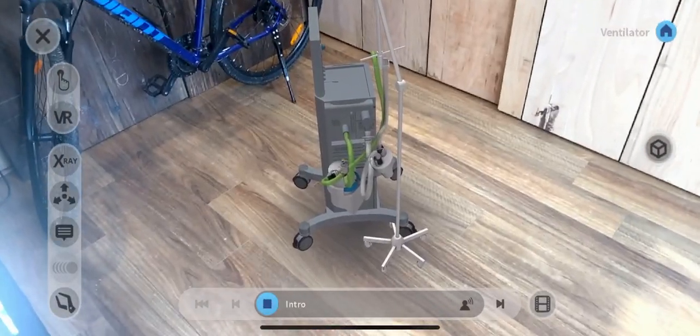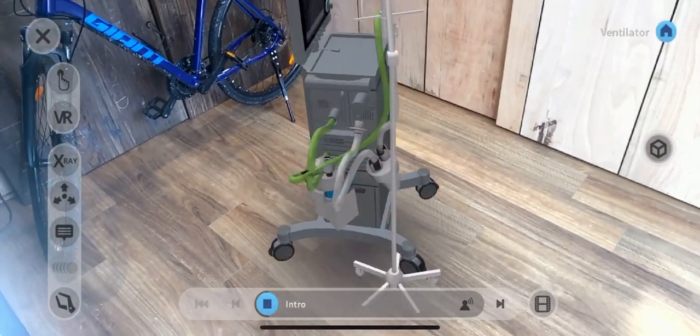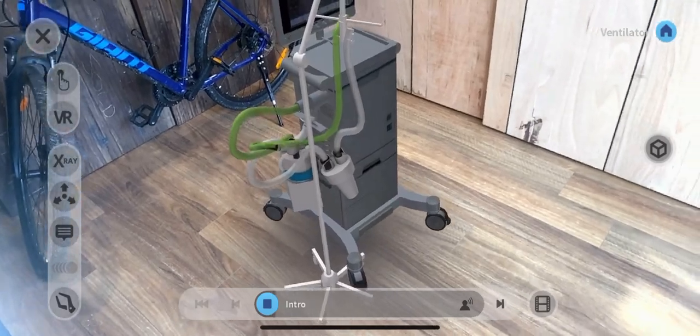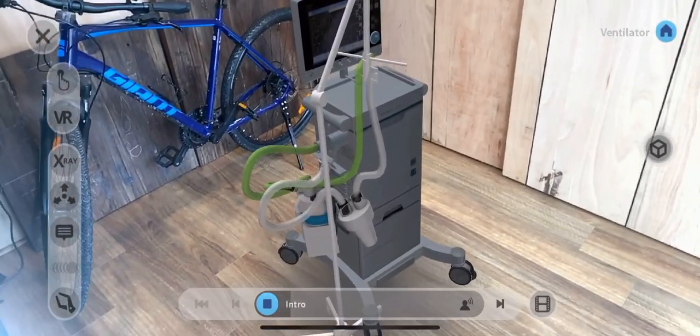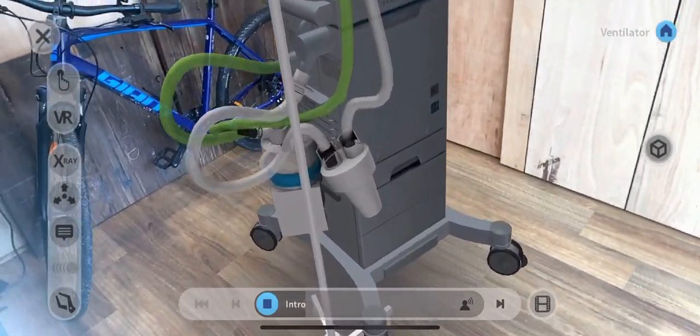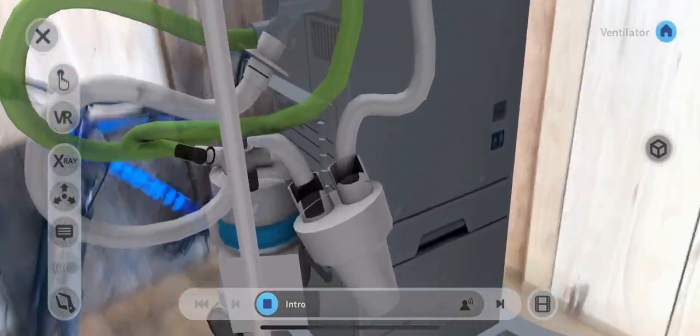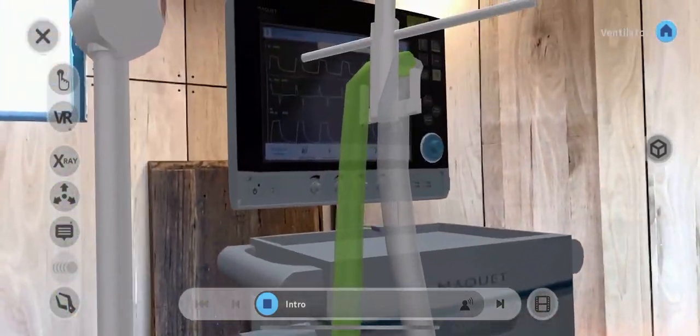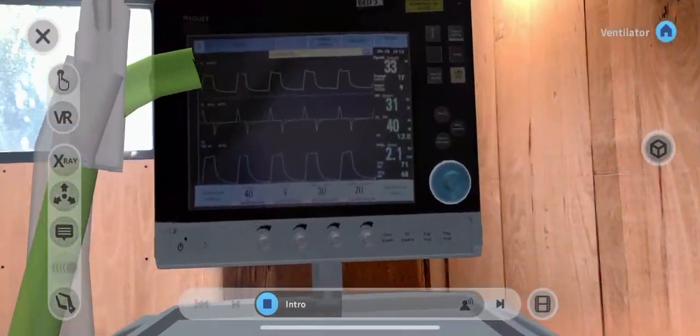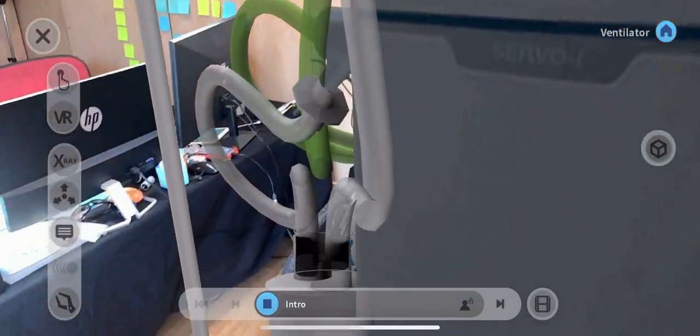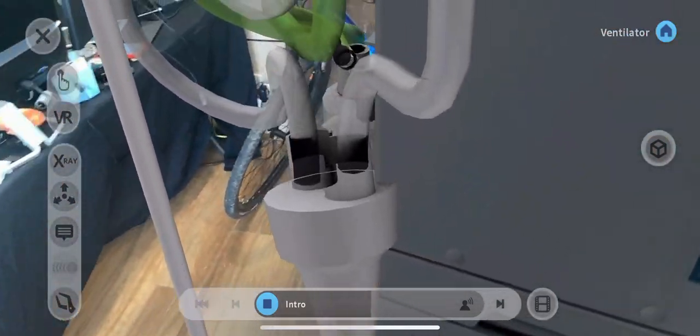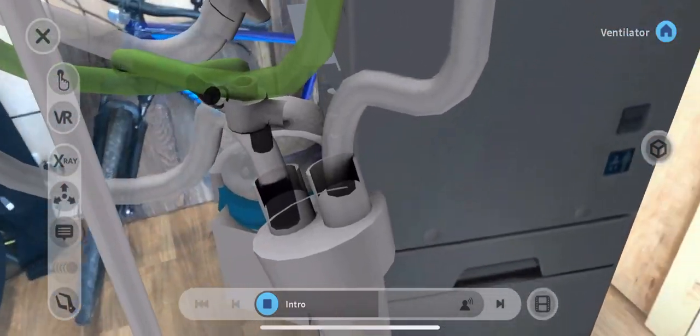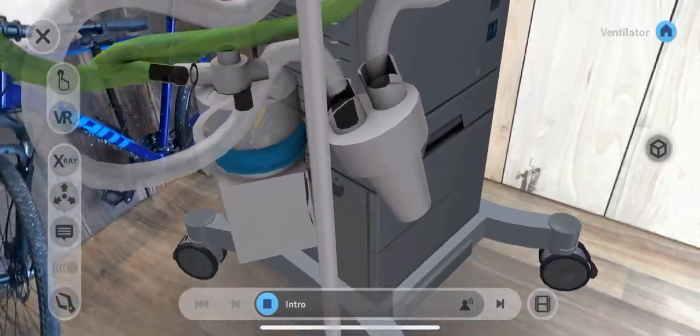Maquet Servoi ventilators are an essential part of patient care to assist with breathing and patient ventilation. The Servoi model can be used on all sizes of patients, which makes this lesson more relevant. There are two primary topics covered in this lesson. You will be challenged to successfully complete the tasks assigned to you from inside this application.